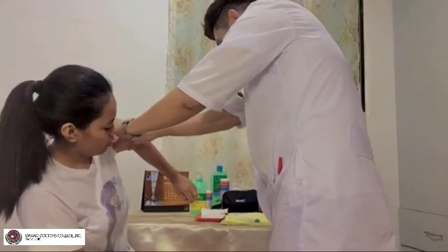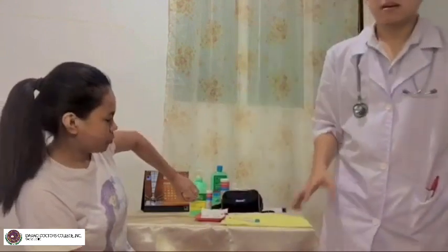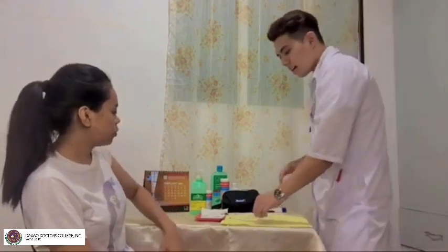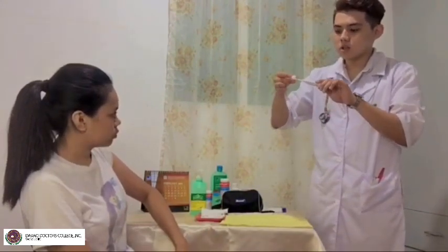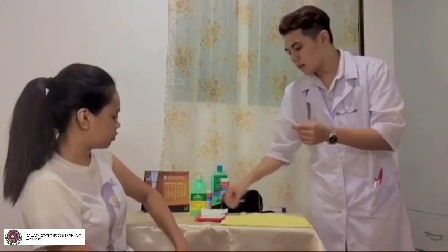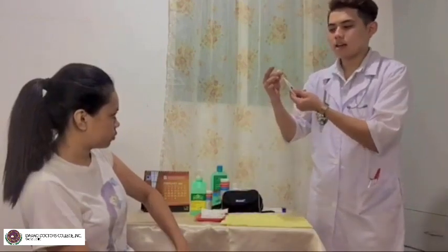Okay ma'am. So, pat the axilla dry, especially if very moist, and place the tip of the thermometer in the center of the axilla and ask the client to lay the arm over the tip. So, before anything else, we really need to sanitize this thermometer. So use a wet cotton and then first is that we need to rub the tip and then to the stem just like this. This is wet and now this is for the dry and then repeat.